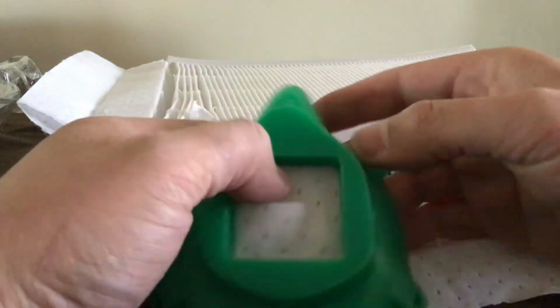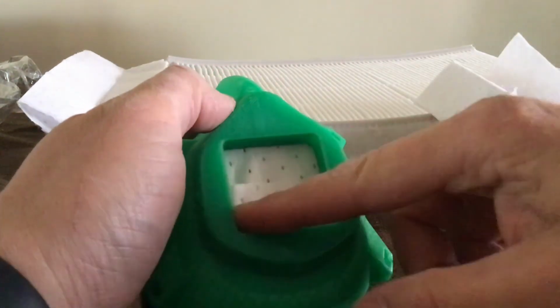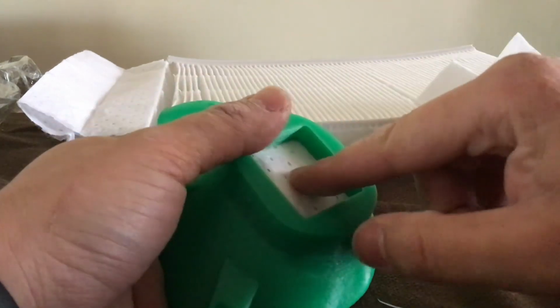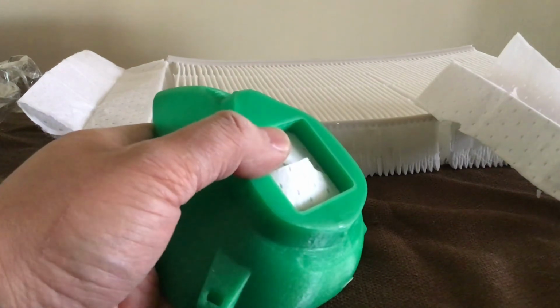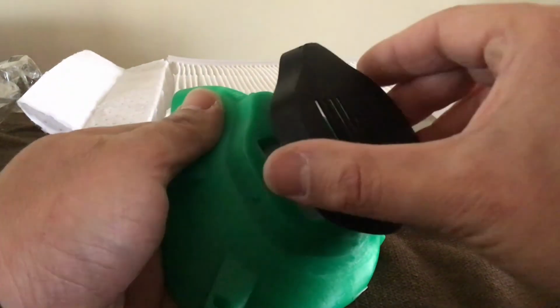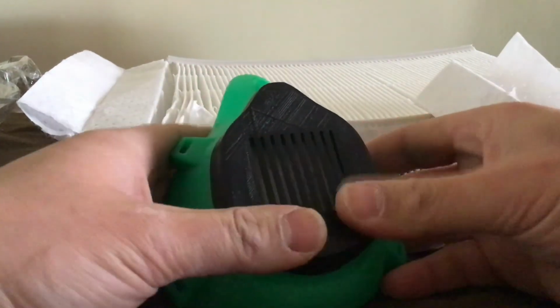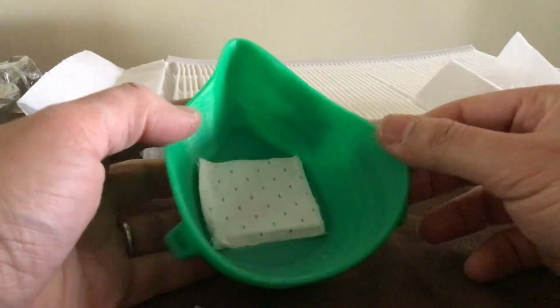So now that leaves the front of the mask, and usually I'll just put like a cotton ball or a piece of fabric in here just to hold this down and in place, and not restrict airflow in front of it. And then in front of that, we'll put the front piece on, and we have an entire respirator.